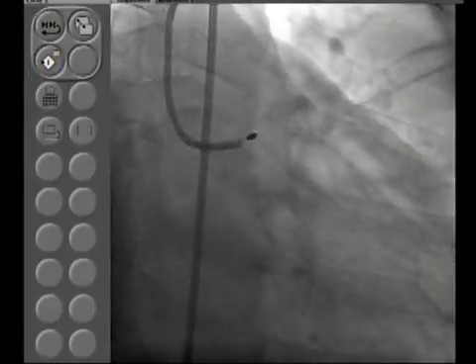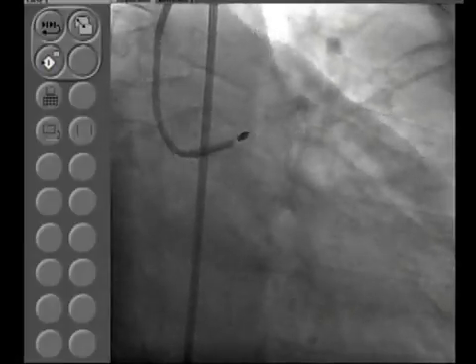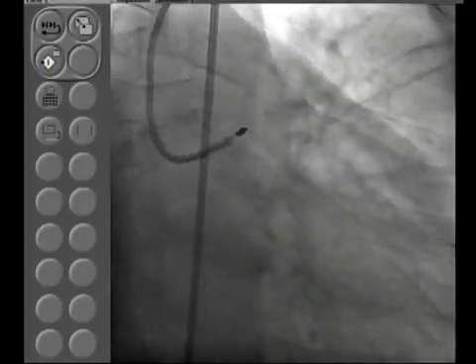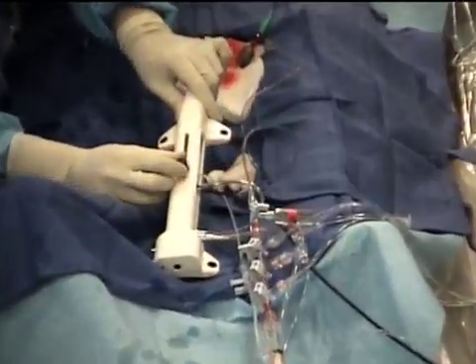And the three important steps: once the burr is in the proximal part of the lesion, what you need to do is, first thing, you have your advancer knob, this one, which is right here.